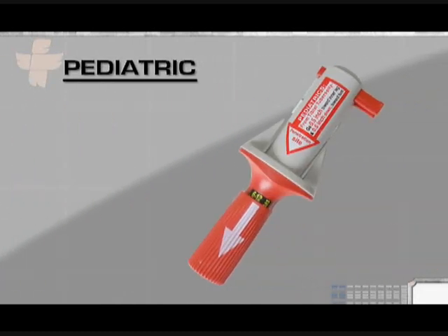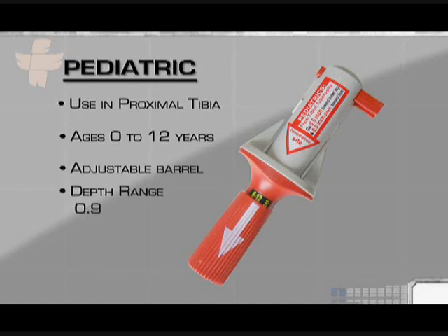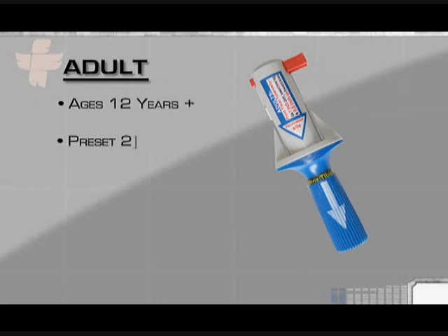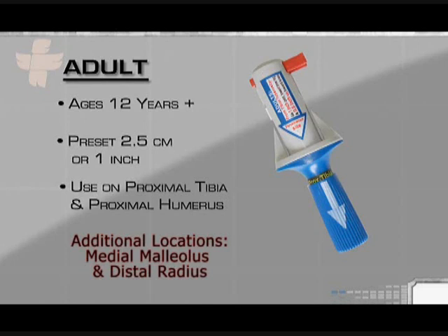The pediatric BIG is intended for use in the proximal tibia on term newborns to children 12 years of age, and features an adjustable barrel to determine penetration depth according to the patient's age. Depths range from 0.5 centimeters to 1.5 centimeters. The adult BIG is intended for use on patients age 12 years and up, is preset to an insertion depth of 2.5 centimeters, or one inch, and can be used in both the proximal tibia and the proximal humerus.